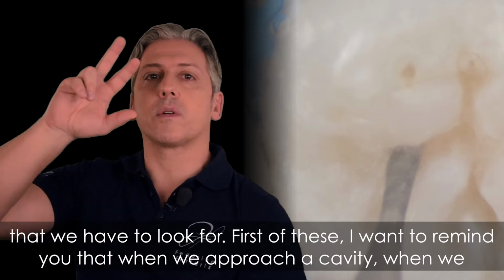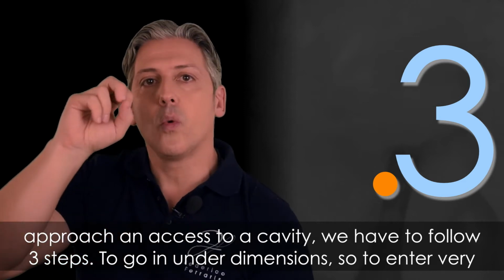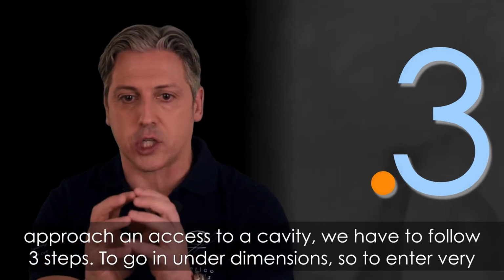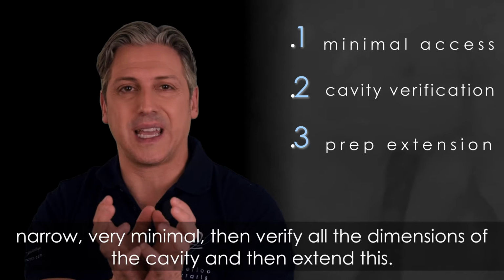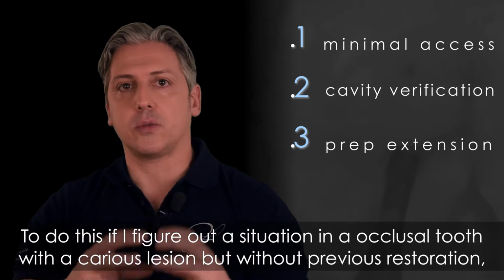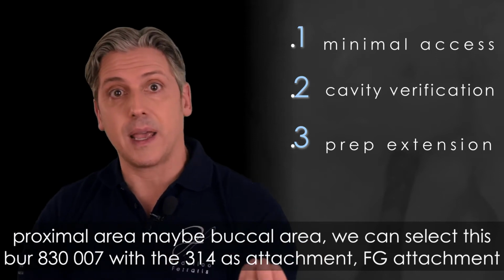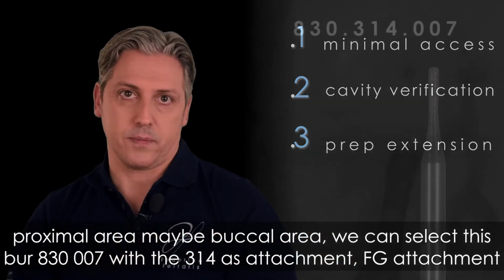First of all, I want to remind you that when we approach an access to a cavity, we have to follow 3 steps. To go in under dimensions, so to enter very narrow, very minimal, then verify what is the dimension of the cavity, and then extend this, okay? To do this, if I imagine a situation in an occlusal tooth with a carious lesion, but without previous restoration, proximal area, maybe buccal area, we can select this burr.